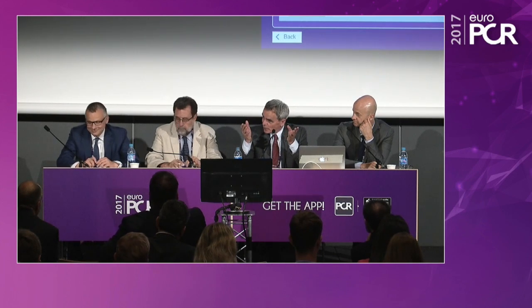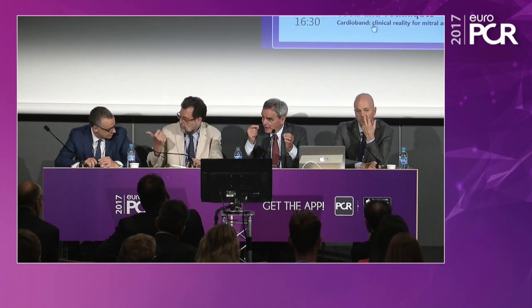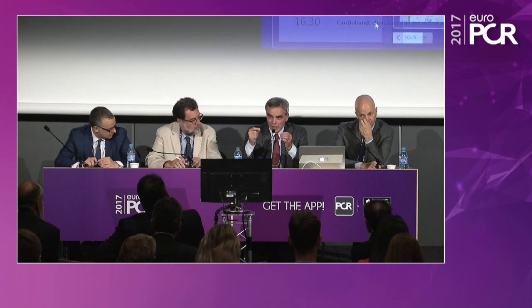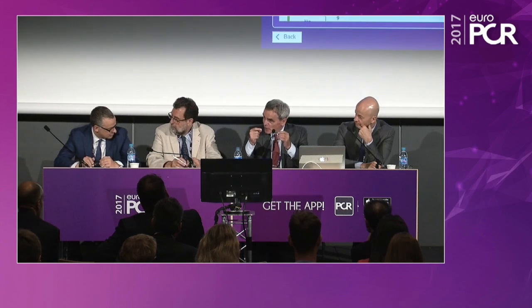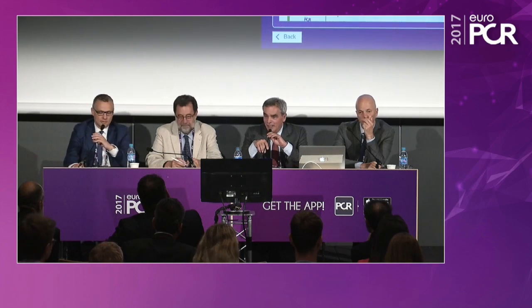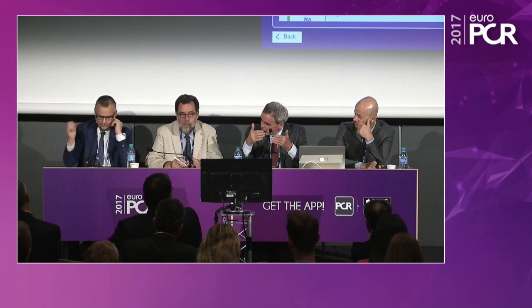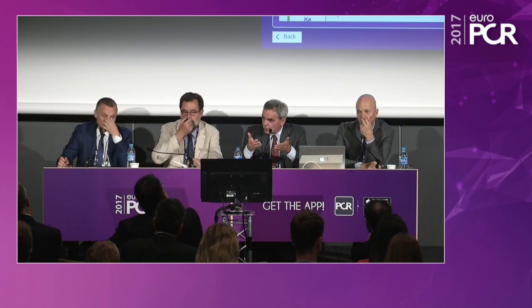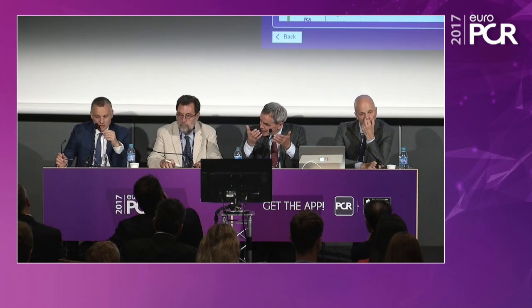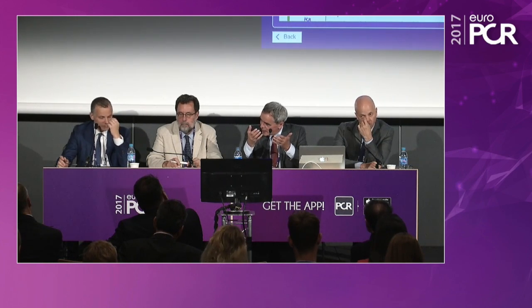And somebody said, I didn't know whether it was you or was it Mike Mack, who said, if I put a needle in the AV node, it causes AV block. That study I would love to see. So maybe you may comment on this. How sensitive is really the AV node, and how aggressive should we be, based on your surgical experience, to move upwards at the septum and to have a more positive effect on annulus cinching without risking to kill the AV node?